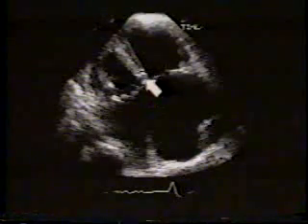Another characteristic feature is shown here. Note that both atrioventricular valves insert at the same plane at the crest of the ventricular septum. Further note that there is no ventricular septal defect evident.